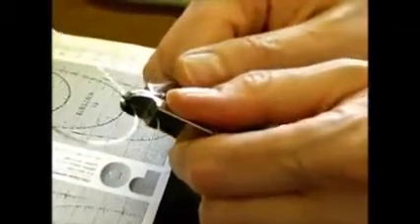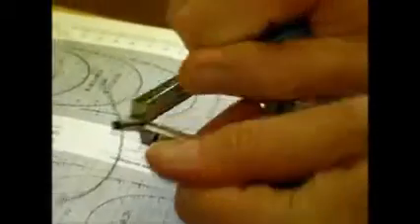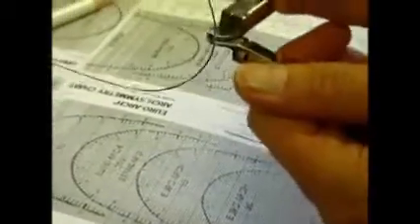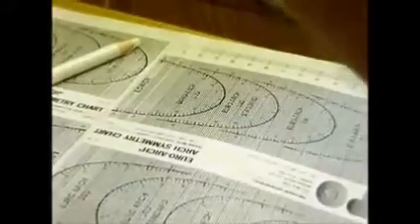So I was going to put palatal root torque in. This is an upper wire palatal root torque. So I'm going to turn this one up and get that. Now the trick to getting both of these twists to the same amount is you can watch the plier, so that the edge of the plier just comes to the gap in it there. But also when you look across the wire, both of these bits should be sort of one behind the other, more or less. Then you know you've put an equal amount of twist on each side.